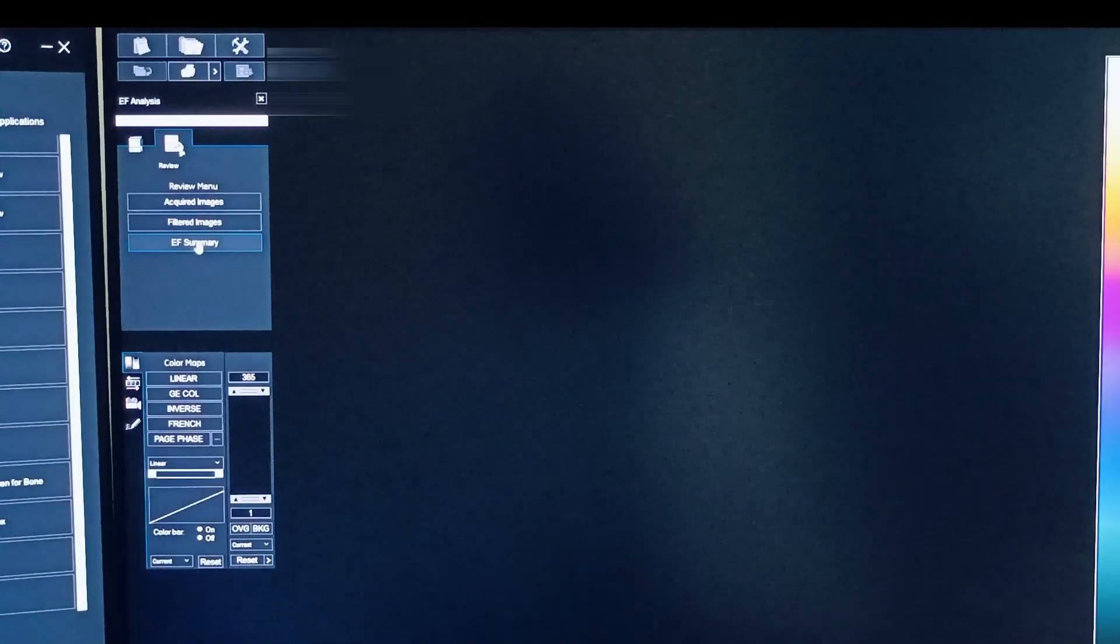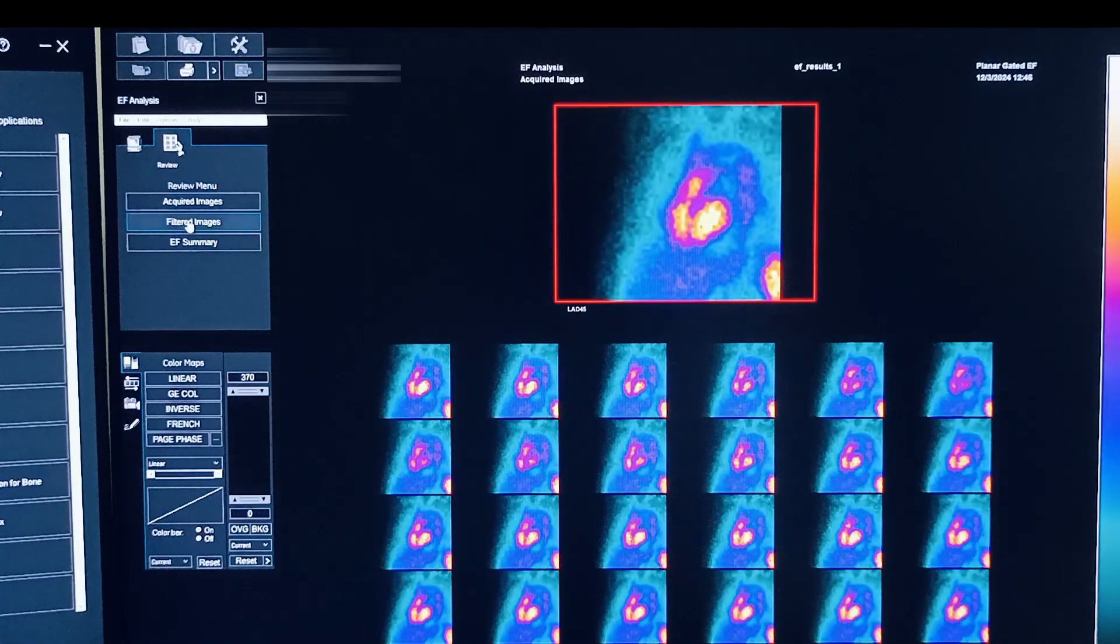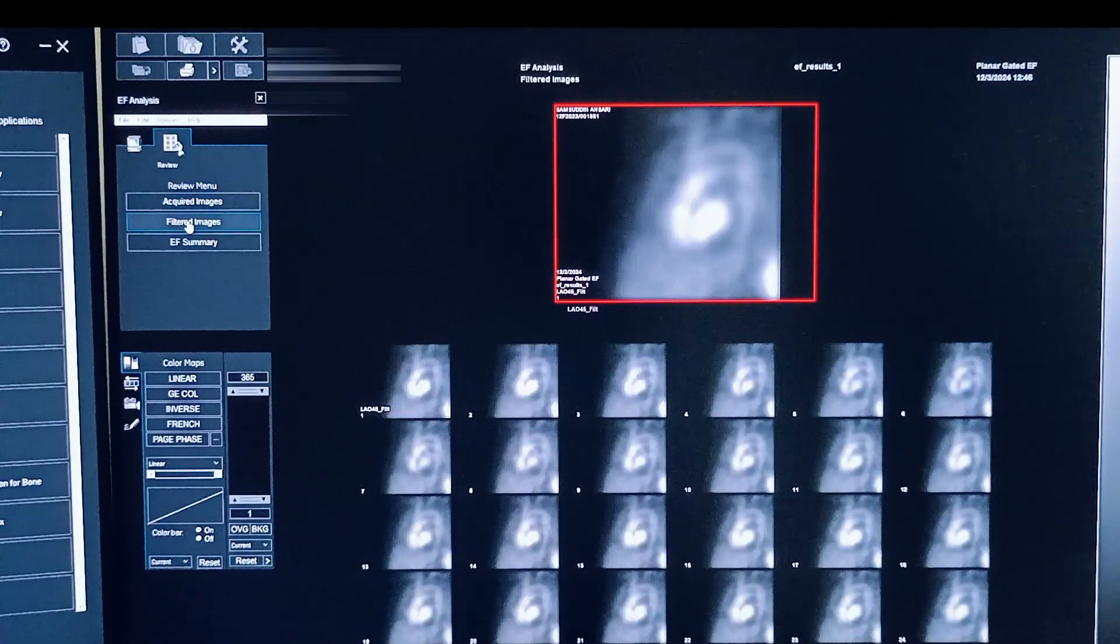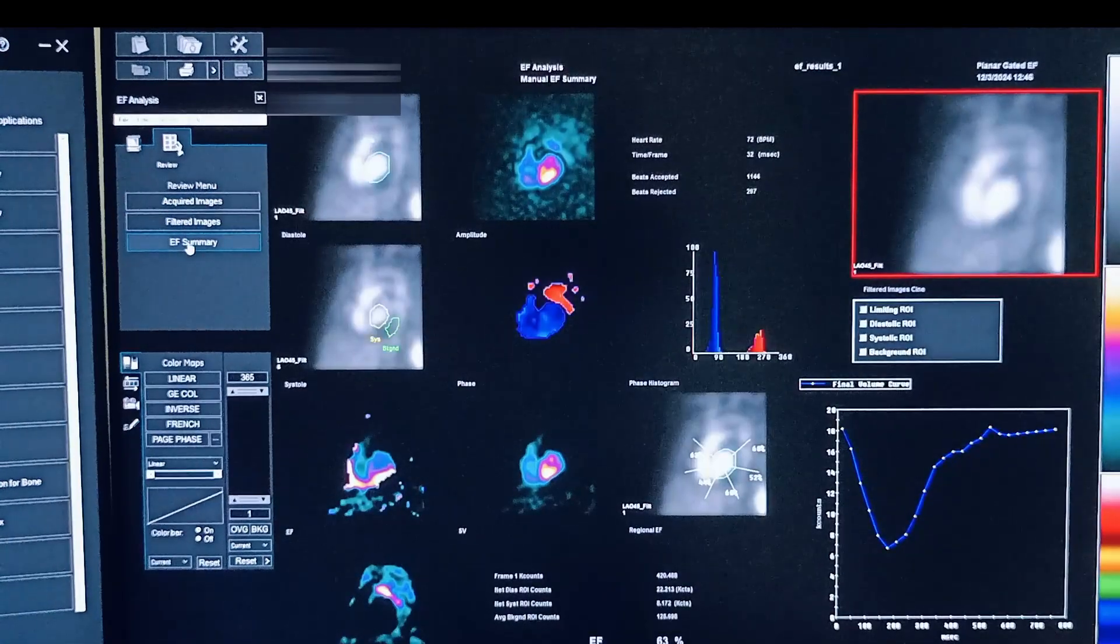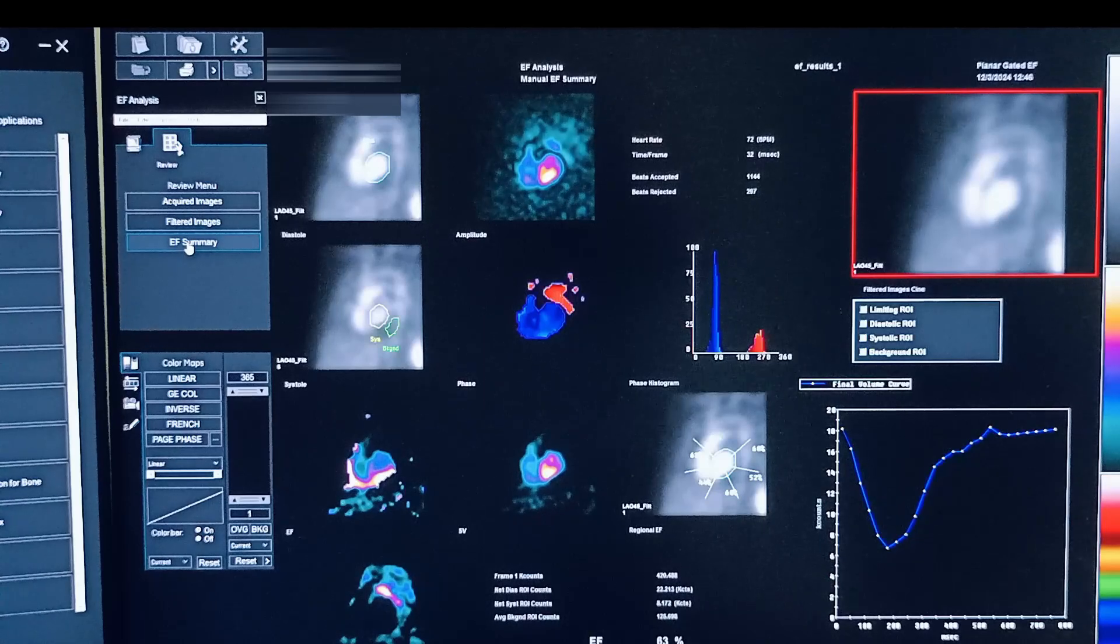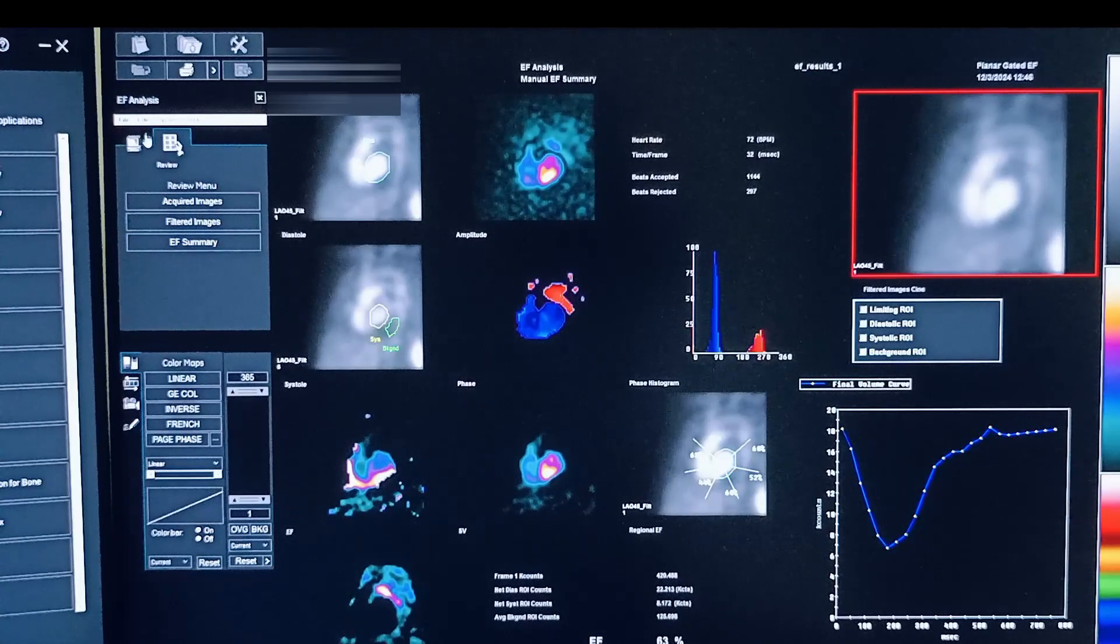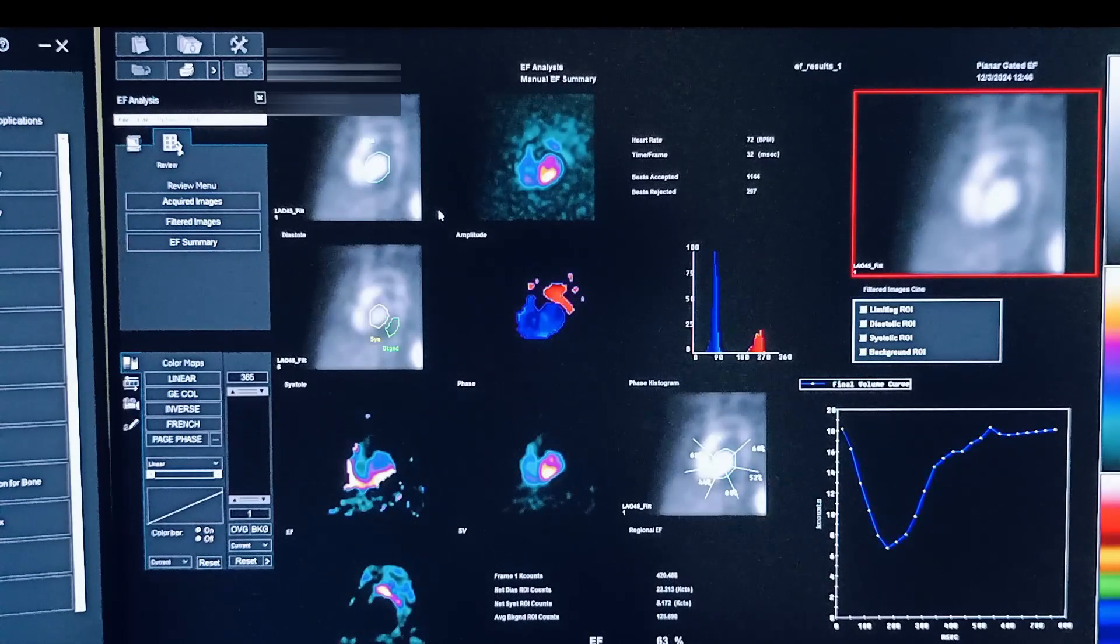And then acquired images, filtered images, and the summary screen. So this will be the complete summary page.